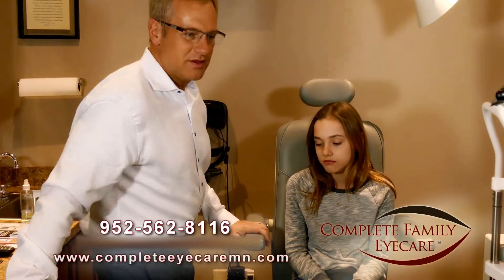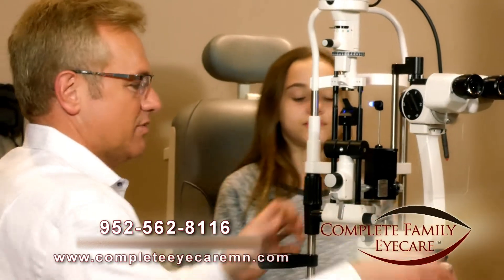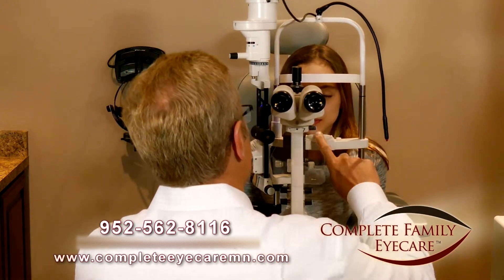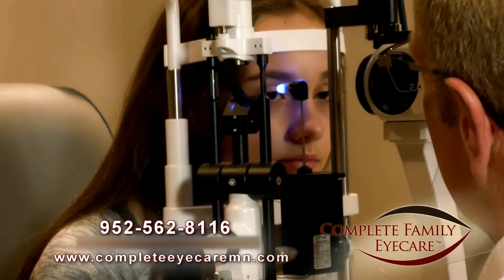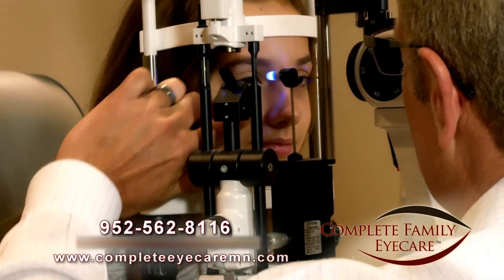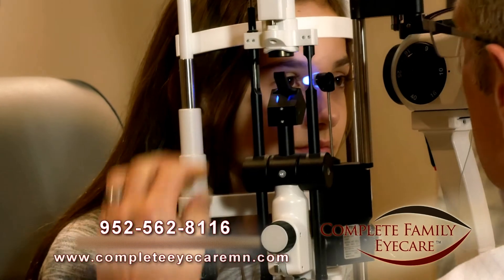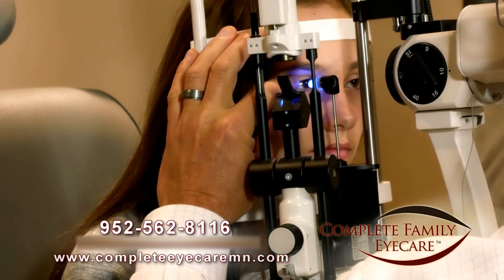Put you down a little bit. Then we'll bring the tonometer close — just this little blue light right here, it just comes really close to the eye. Chin in the chin rest up there for you, Belle. Head tight right there. Look right up here at the little blue star. Open real big. It's just going to come close. No air pumping, I promise.